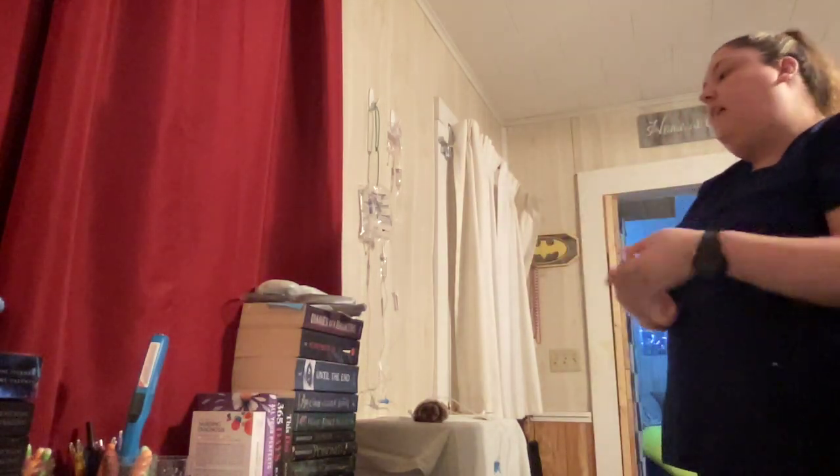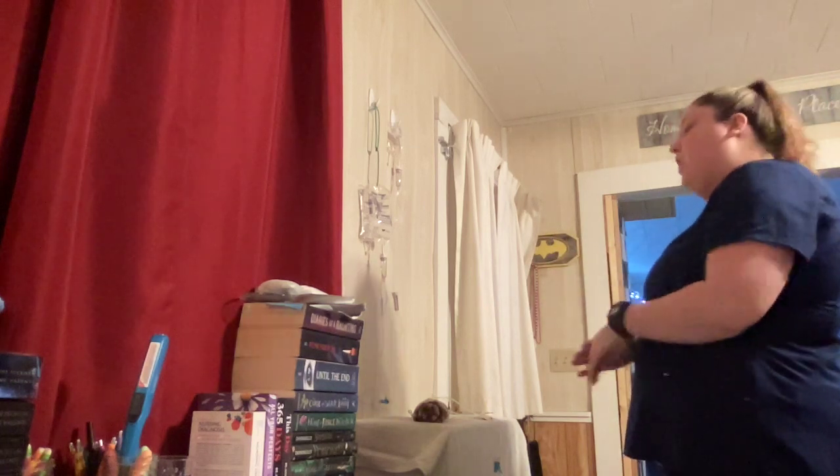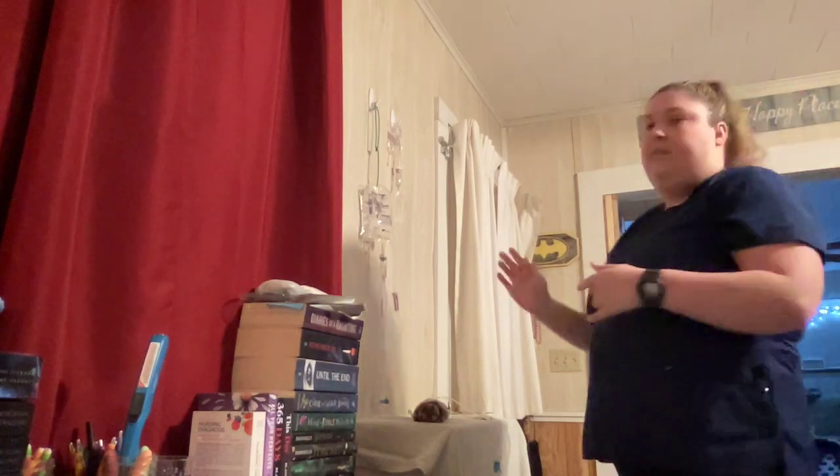Ellen, do you need anything else? You've been in a private room the whole time, so you had privacy. I'm going to make sure you're in a safe location. The bed's down. You have a call light if that's available. And lastly, I'm going to document. Do you need anything else? No. So that would run for 30 minutes, and I would document. So I think that's all. Thank you.